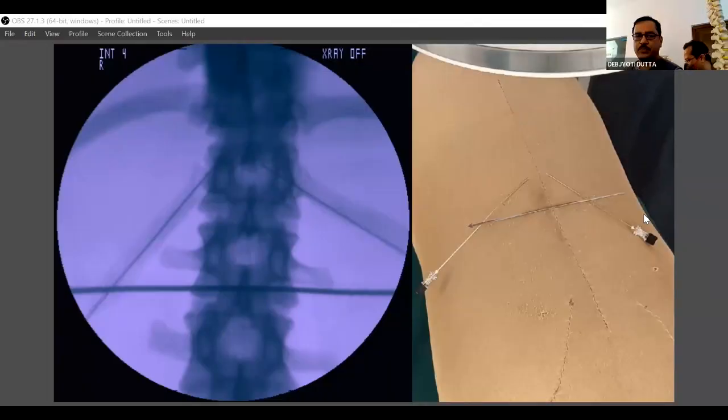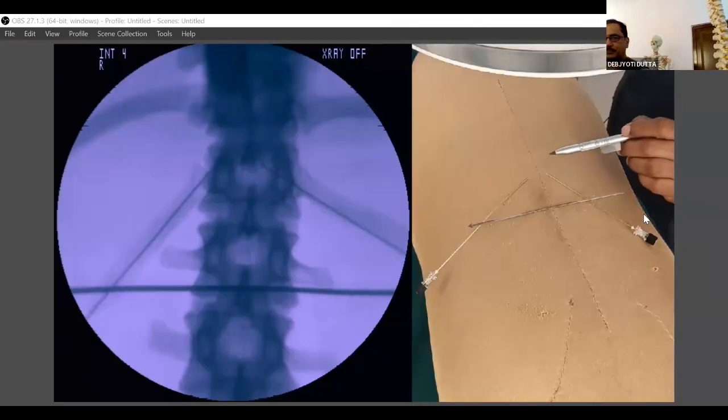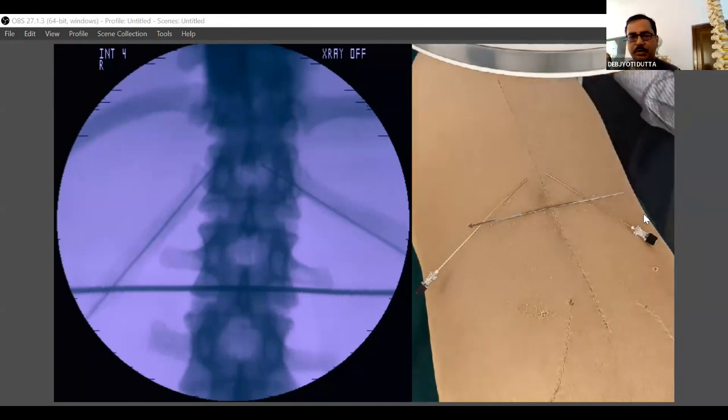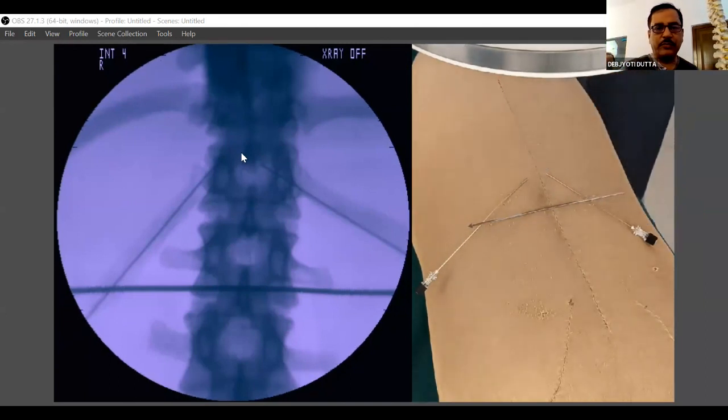And if we are going in front of the aorta, through the aorta, then it is called transaortic. But the original Kappis approach was on either side of the anterolateral part of the vertebral body. Look here. Many times we draw this picture. So how is this picture drawn? This is your T12.